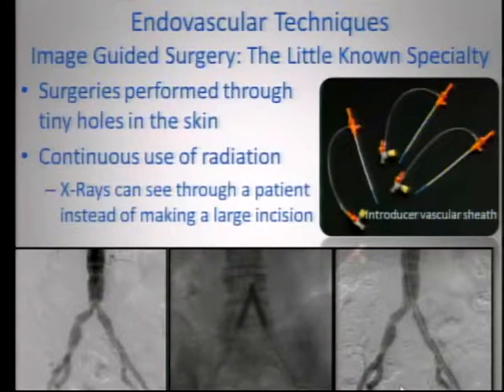You can see what a vascular sheath is there. It's a little conduit that goes inside the patient and comes out of the patient, and has a little hemostasis valve to help prevent fluid from coming backwards. We work through these little openings and do all of our procedures through them using x-rays. Here's an example: a patient who has blood vessel narrowing, and we put some tools in, use some balloons and some stents, and we open it up. This is what we do, and we do this all over the body.